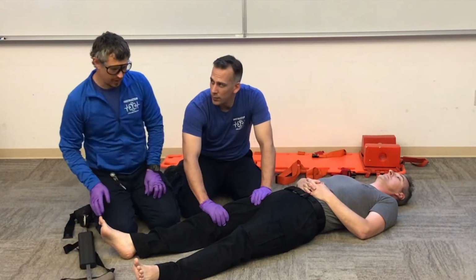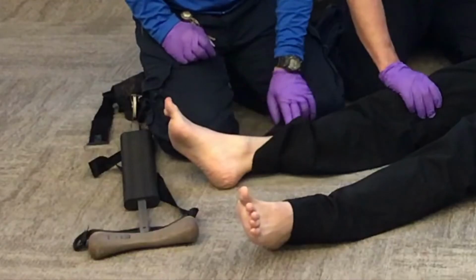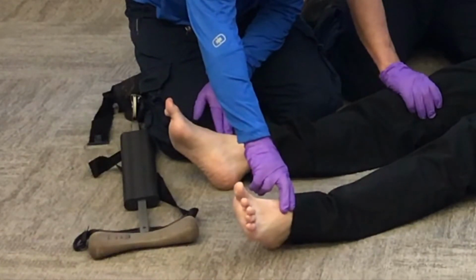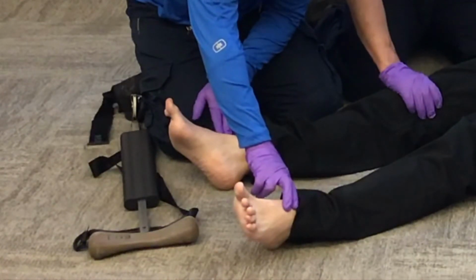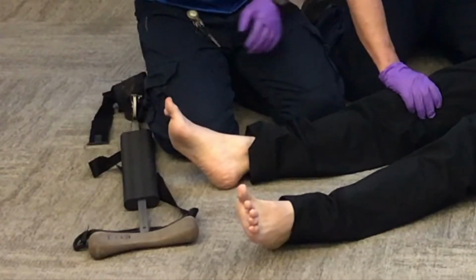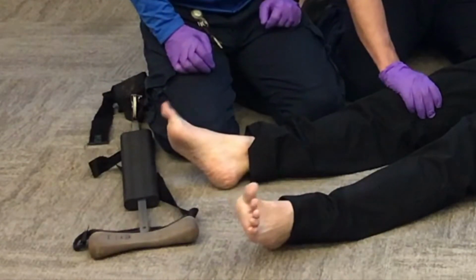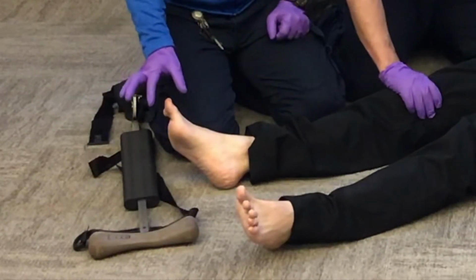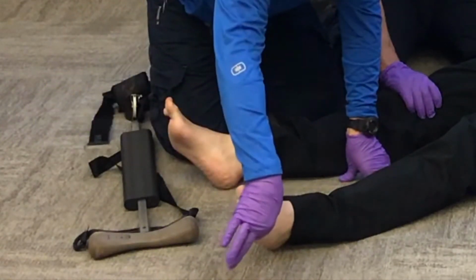Before we put on our device, we're going to check our CMS. We're going to compare our CMS, our pulse of the injured extremity to the non-injured extremity. Right now I have equal bilateral pulses. I want to check my efferent motor neurons by having my patient wiggle their toes. Chandler, can you wiggle your toes? And then check my afferent or sensory by having them tell me which toe I'm touching. Chandler, can you tell which toe I'm touching? Big toe. And can you tell me which toe I'm touching?